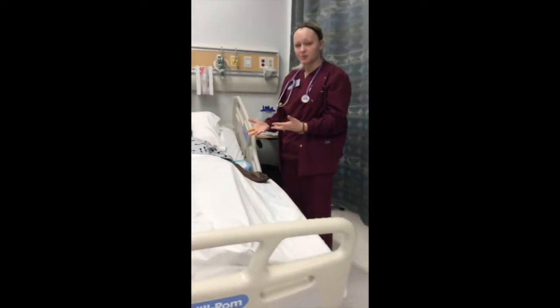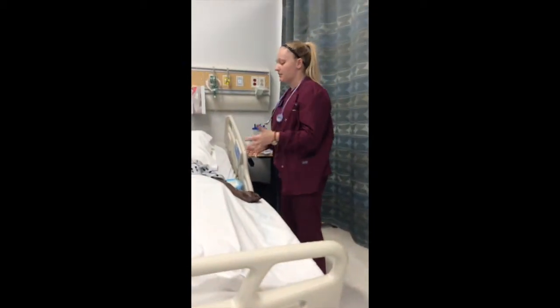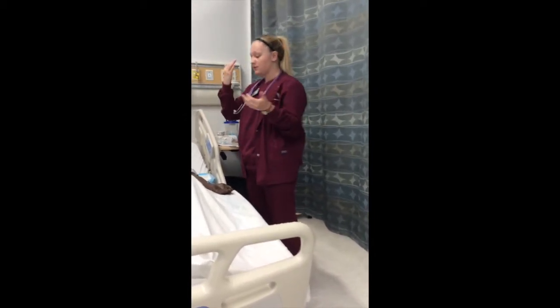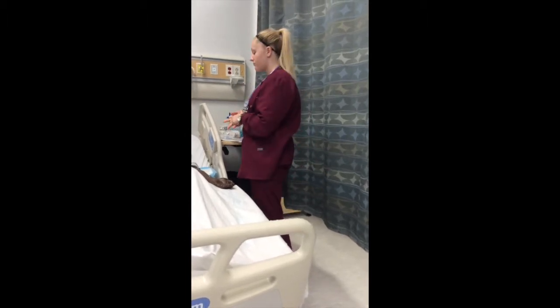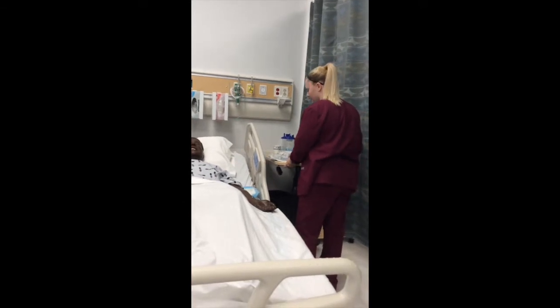So depending on the patient, I'm going to explain to them the reason why they need this tube. I'm going to ask them if they have any questions. I'm going to go ahead and kind of go through the procedure with them. I'm going to tell them that what we do is we take the tube and we insert it through the nose, and then we have them swallow, swallow, swallow until it gets all the way to the belly. And I'm going to tell them it's going to be hooked up to suction. So if they don't have any questions, I'm going to go ahead and prepare.